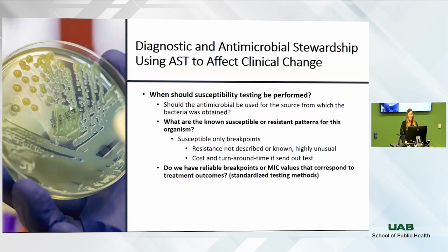So, and then the other question we ask is, do we have reliable breakpoints or MIC values that correspond to treatment outcomes? So if what I'm giving the clinician is just a random drug on a random plate with a random bacteria I set up in a lab and I give them a value of 3 with no S or I or R linked to that, do you think that's usable clinical data? No, not at all. It's not usable clinical data, but I'm still going to bill you for it because my lab has done it.